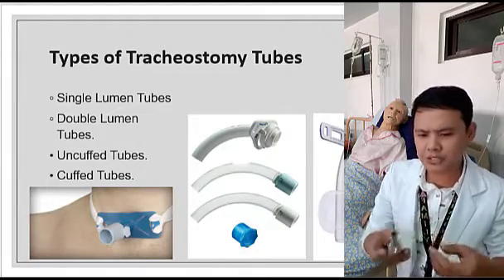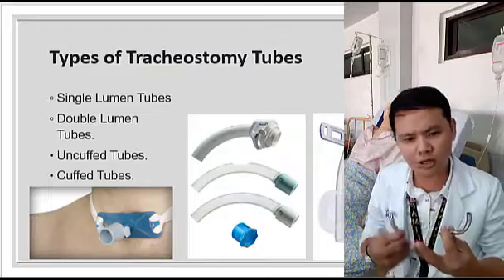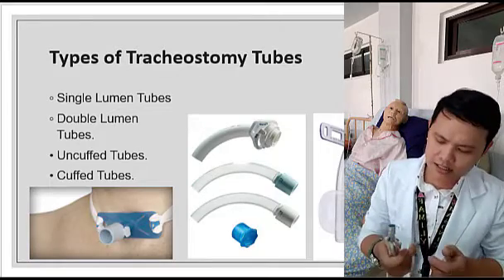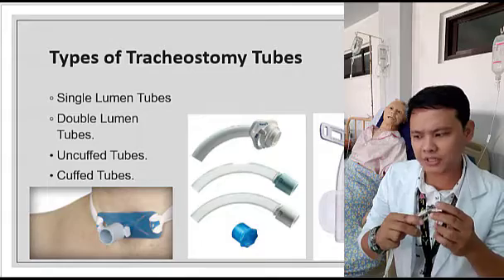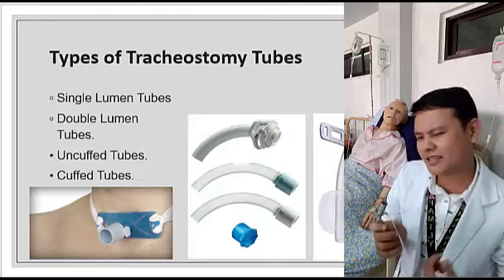Another pro in using the double lumen tube is that, like I told you earlier, it is easy to clean and you can use it for a long period of time unlike the single lumen. Okay, it is easier to clean. And aside from that, this one can be used when our patient is ready to speak. Okay, we can use this double lumen, unlike the single lumen.